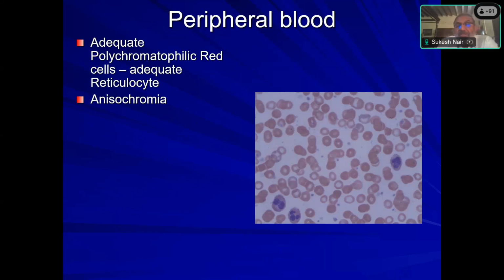Now the issue is, I want to identify whether the hypochromic red cells are a new story. That means it happened recently, because you must realize that the lifespan of a red cell is 90 to 120 days. So whether these hypochromic red cells have been there for 120 days, and the normochromic red cells have happened recently, basically means, okay, fine, this guy is recovering from it. But if the hypochromic red cells have happened recently, that means we are looking at a bad story.